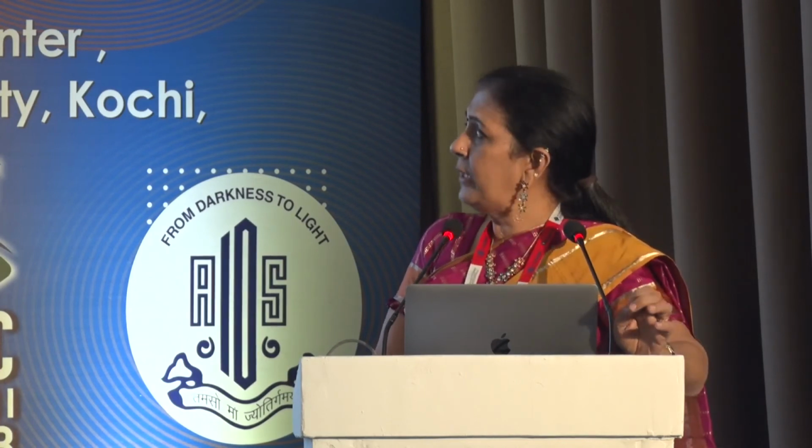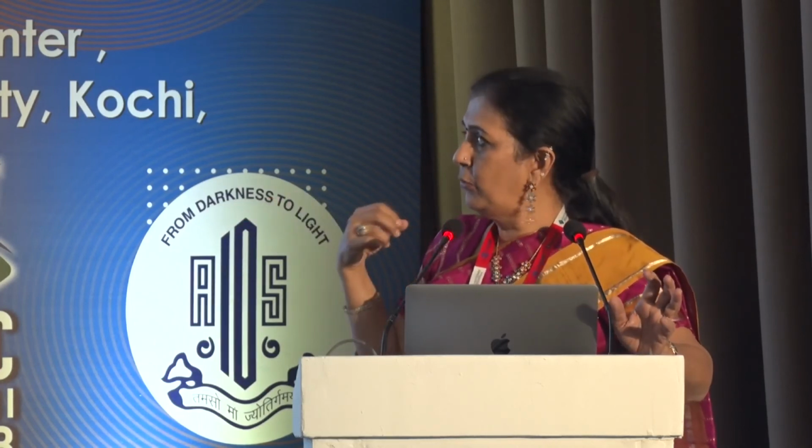This was a patient who came to me 6 weeks after surgery done elsewhere with diplopia, and he said that a CTR was placed and the surgeon had told him. But then I knew there was no choice. It was quite subluxated. I removed the IOL. But the message here is that there is a CTR there which has to be removed. So I go ahead and remove the IOL.